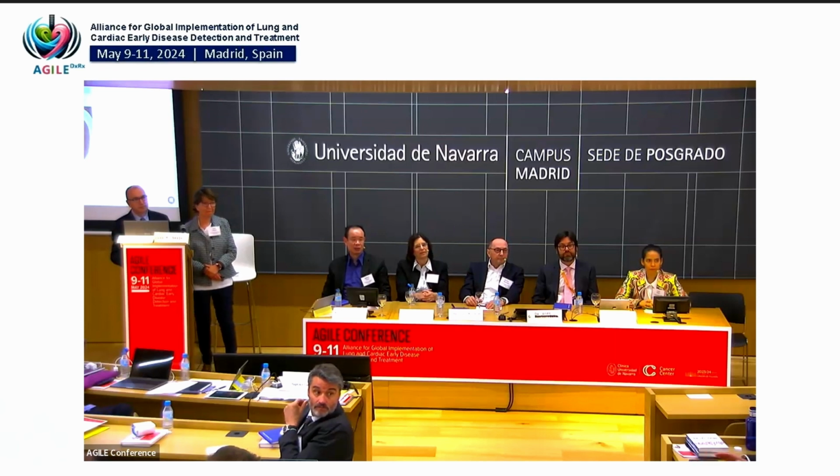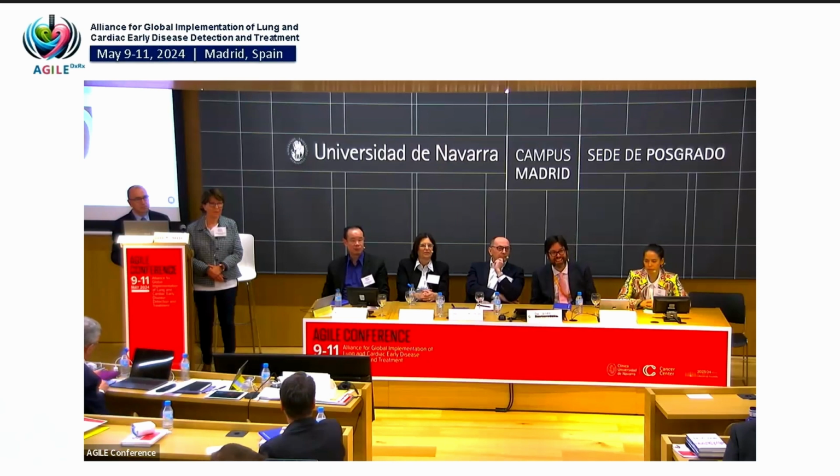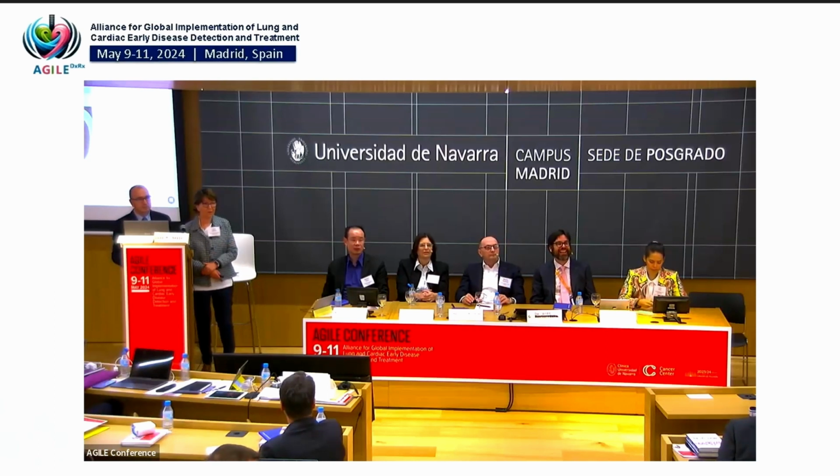Well, all of these options may seem reasonable, but I think we should start off by considering what is the pretest probability of one disease or the other. We know nothing about the patient. We are just looking at the picture. We don't know how old he or she is. We don't know whether he smokes or not. So it's difficult to make recommendations under these circumstances. I'd like to know a little bit more. As our colleague from South America said, I would consider TB first. Why? Because she lives in a country with a high incidence of TB. But maybe it's not the case for us.